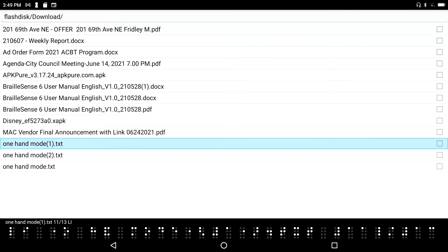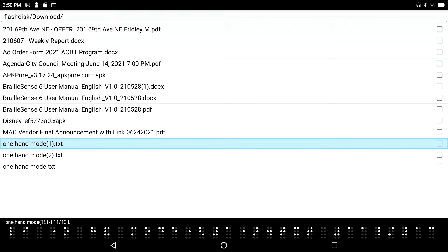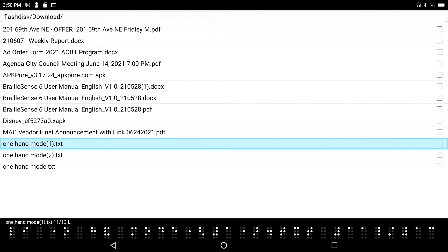Email and file attachments. The BrailleSense is capable of sending and receiving file attachments from within the HIMS email client. All kinds of file attachments, whether you're talking about documents, Excel files, PowerPoint presentations, MP3 files, etc.